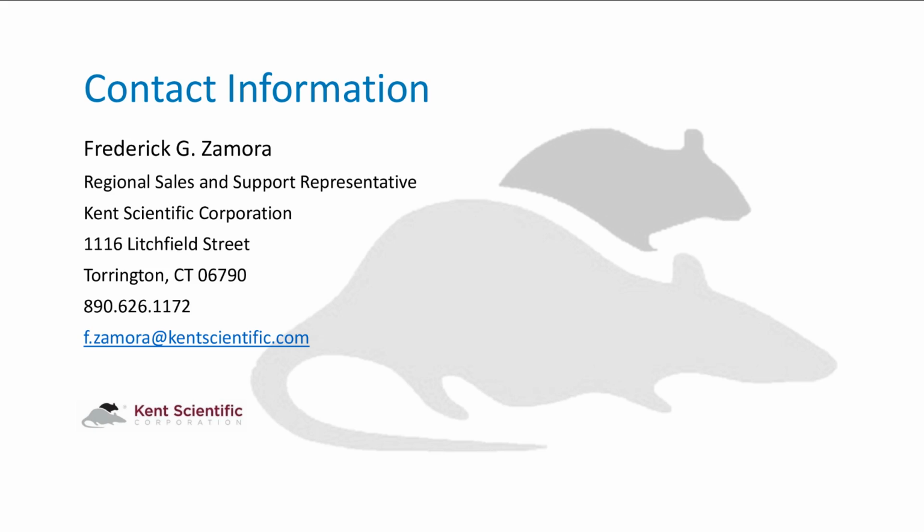Yes. So we actually have done in-house dosimeter studies for waste anesthetic gas exposures. So we can send that chart to you if you would like to reach out to me, and I could forward that info to you as well. And then let's see, there is another part of the question I didn't answer. Have you tested it with monitoring badges?